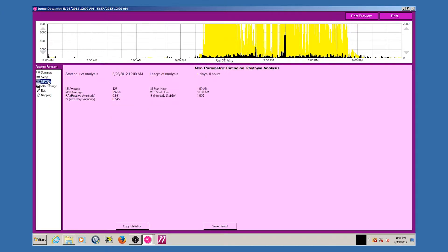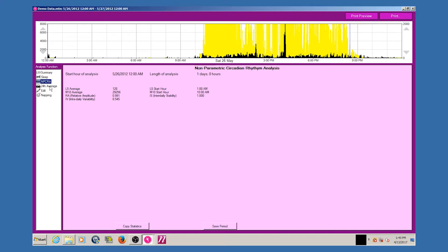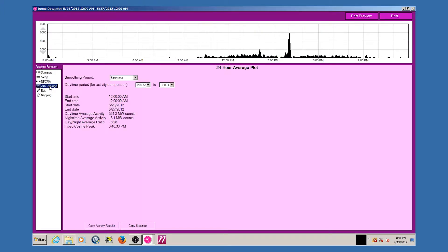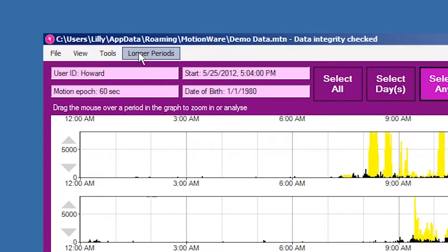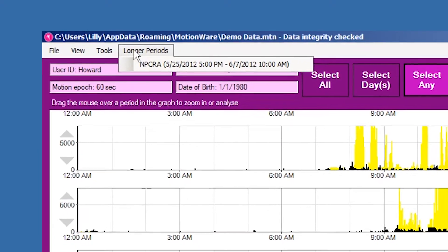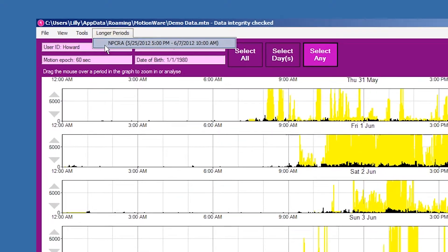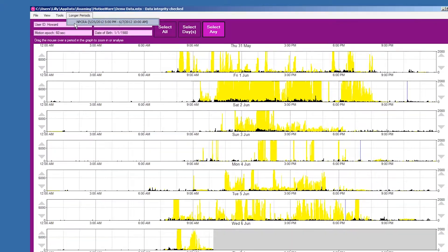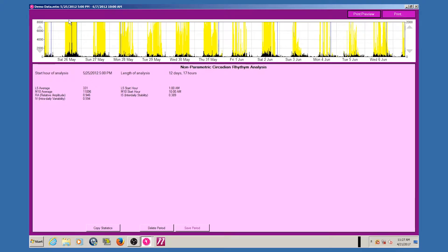If the saved period is longer than 24 hours, i.e. for a NPCRA analysis, then the highlight is not shown in the graph. These longer saved periods may be chosen from the long periods menu in the motion-wise window.